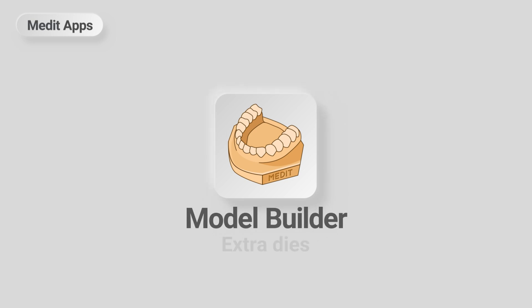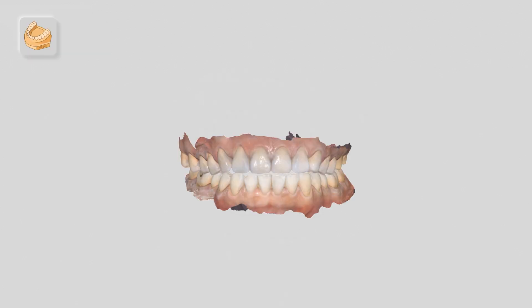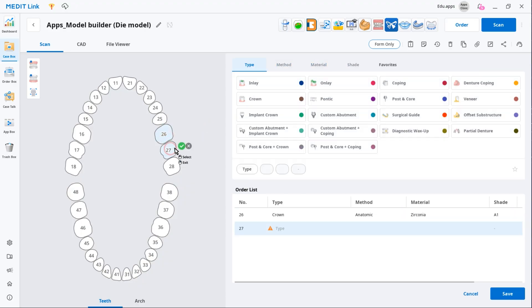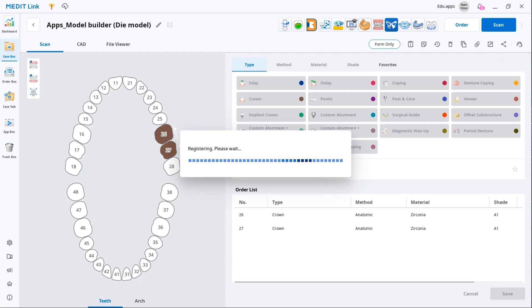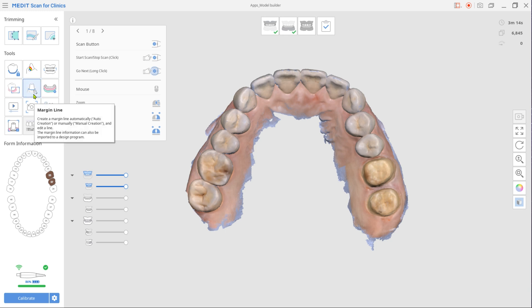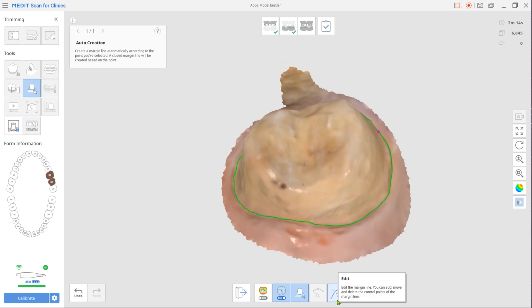This is a quick guide on how to design a model with extra dies using the Model Builder app. You will need the scan data to work in the app. Create a new case, select Designated Restoration as Product Type in the form, and then scan both arches. A tip here is to create margin lines right in Medit Scan for Clinics, so they could be later automatically imported to Model Builder.